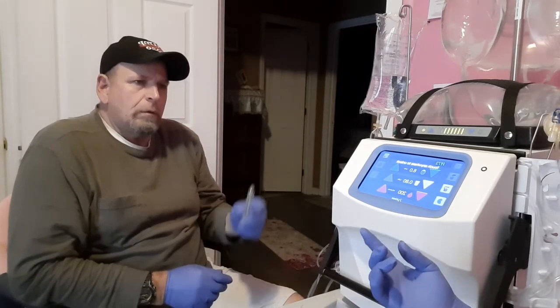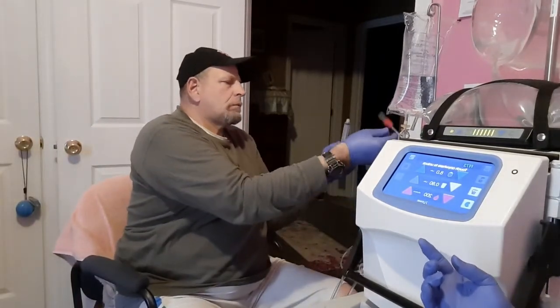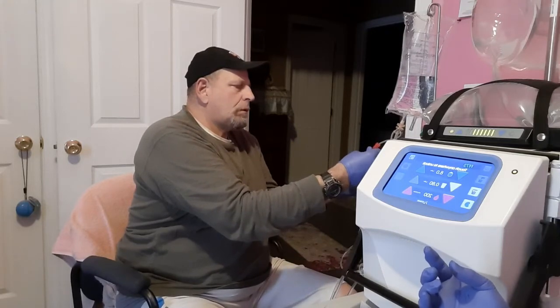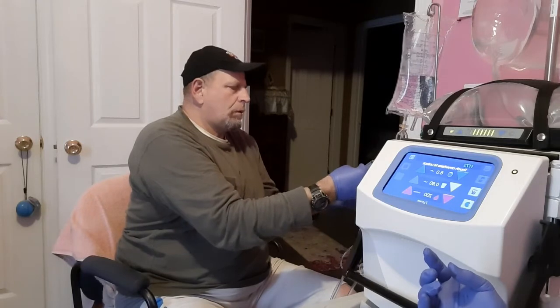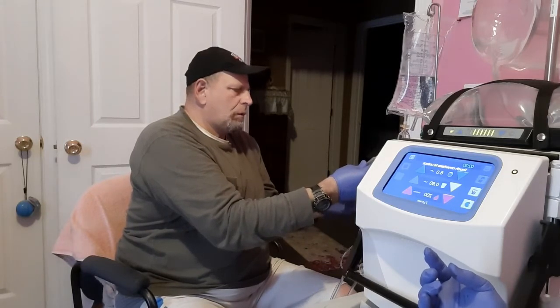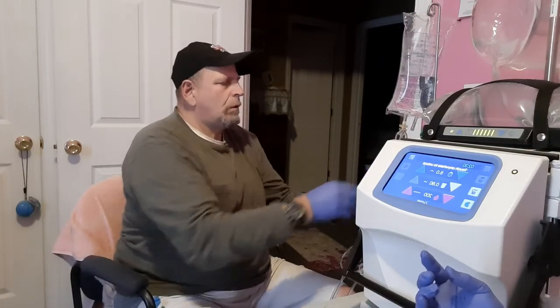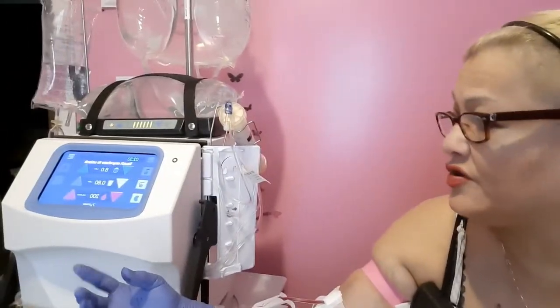Now, Hofstra has to take the 10 milliliter syringe of the second one, and he's going to connect it to the arterial. He's going to then unclamp and pull 10 milliliters of saline from the bag, and then he's going to clamp. At this point, we are ready to dialyze.